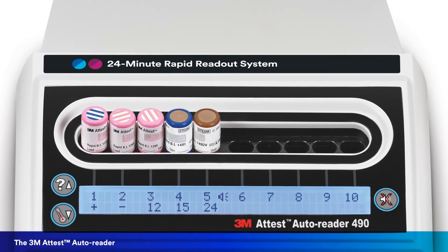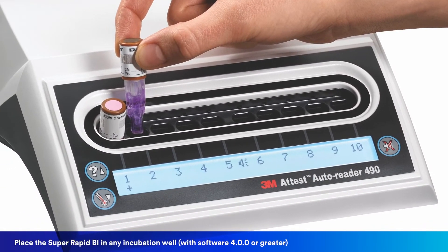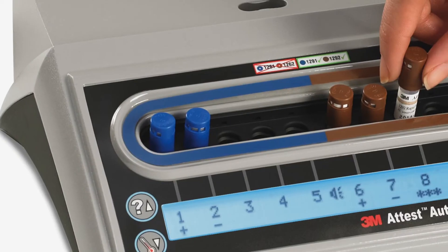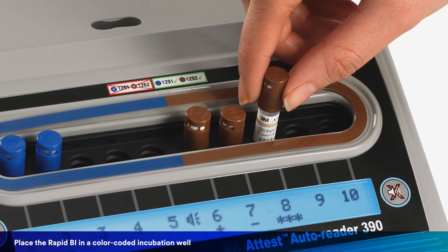Once you have completed these steps, you're ready to place the BI in the 3M Attest Autoreader. For super rapid BIs, place the BI in any well of the model 490 Autoreader. For rapid BIs, you want to ensure that you are placing the BI in a color-coded incubation well in a model 390 Autoreader.